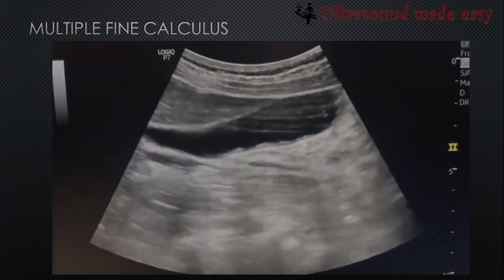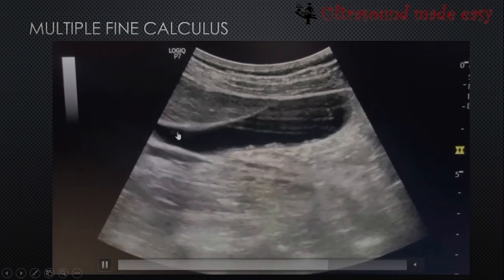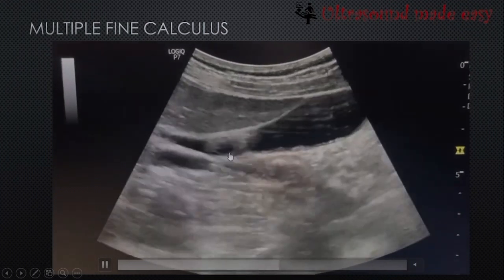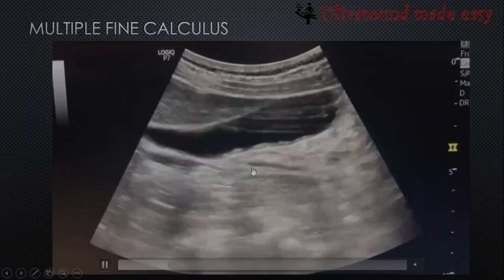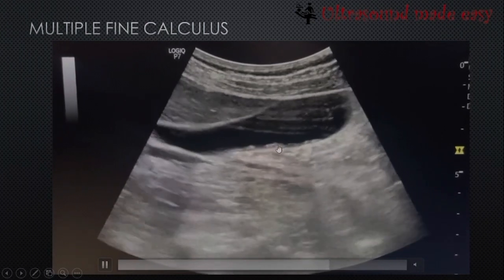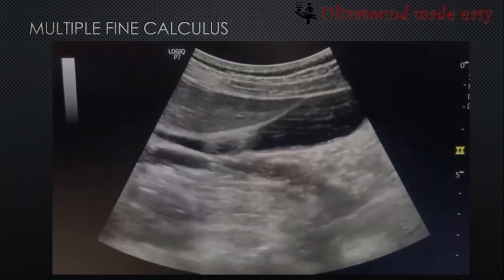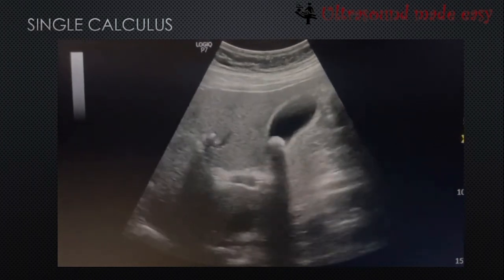This is case one, in which you can appreciate that this is the gallbladder, clearly a distended gallbladder. These are multiple fine calculi, and acoustic shadows are not so visible in this case. Here you can find acoustic shadows. These are multiple fine calculi, subcentimeter in size. So this is the common case, and now we will move to the second case.